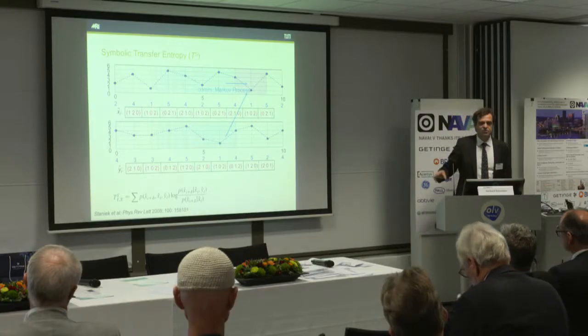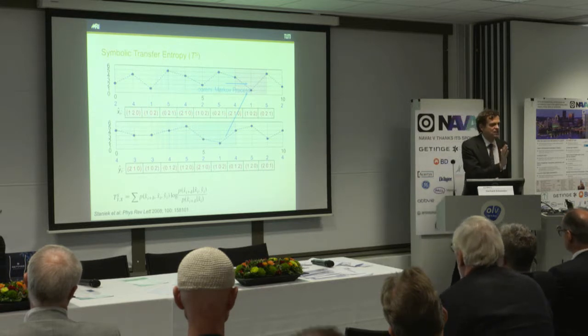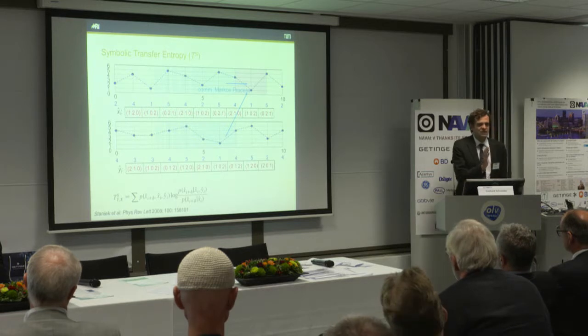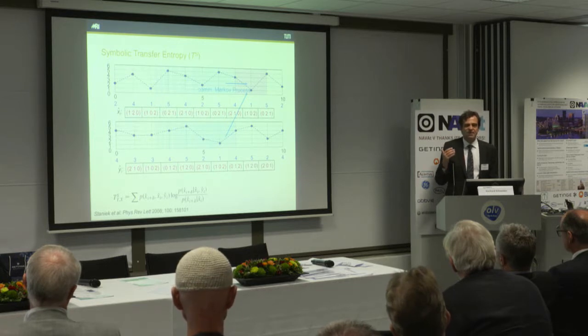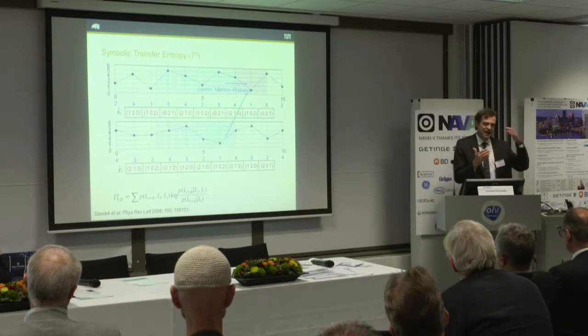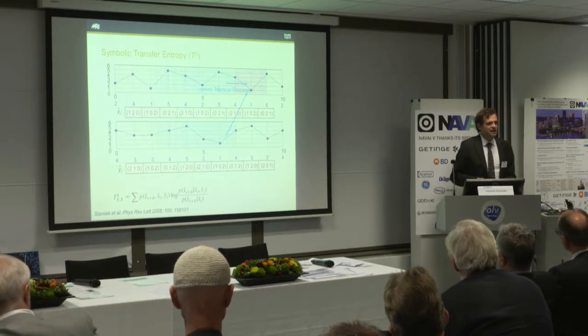Now, you can calculate the future of EEG activity not only for one channel, but for more channels. And then you have to look at the difference between predicted and actually occurring activity. You can take the other channels into account: how much information from another channel is required to influence the predicted EEG in such a way that the actual EEG occurs, which allows you to analyze the information that was contributed by another EEG channel.